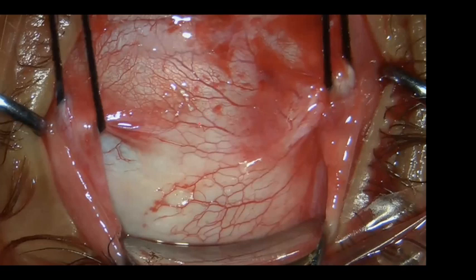Sometimes when the orbit is tight and the exposure is difficult, you can use a superior rectus traction suture. This will facilitate the exposure. So the most important item while putting an implant is a good exposure. You cannot place the implant in an area where there's a lot of fibrous tissue or where the implant is not resting easily. The implant will migrate anteriorly.